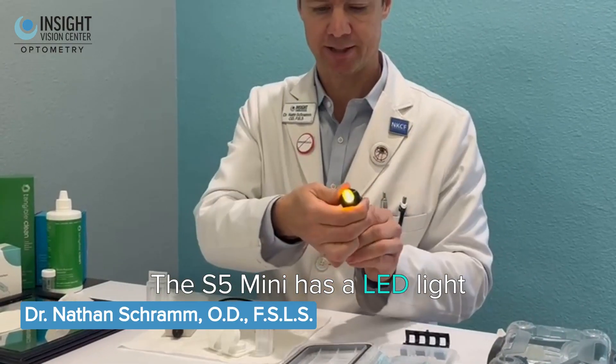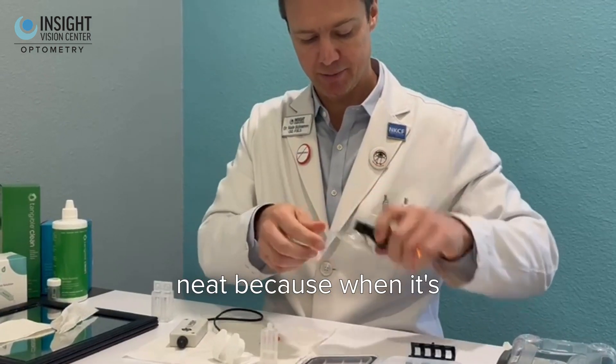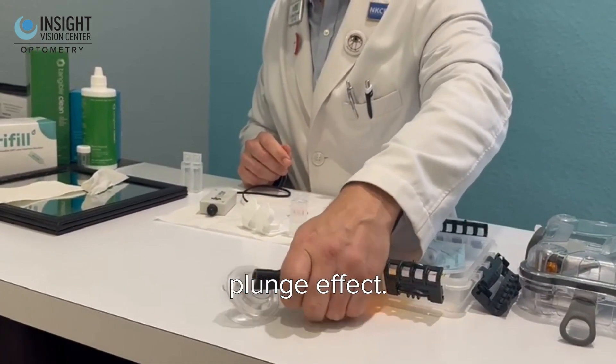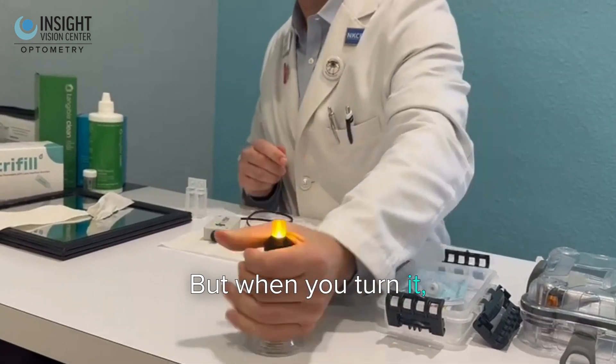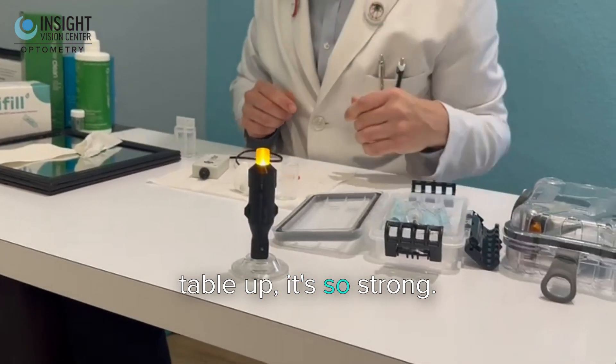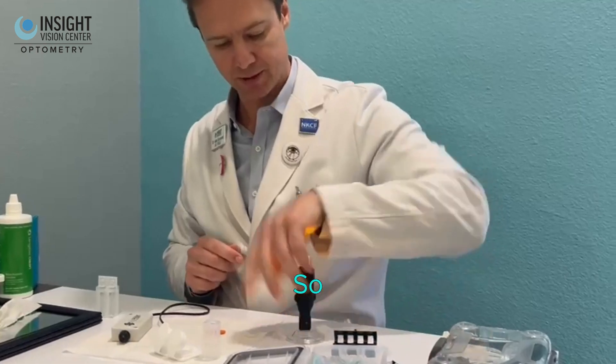The S5 mini has an LED light on it as well, and the plunger is kind of neat because when it's out of position it doesn't have much plunge effect, but when you turn it — I could literally pick this table up, it's so strong.